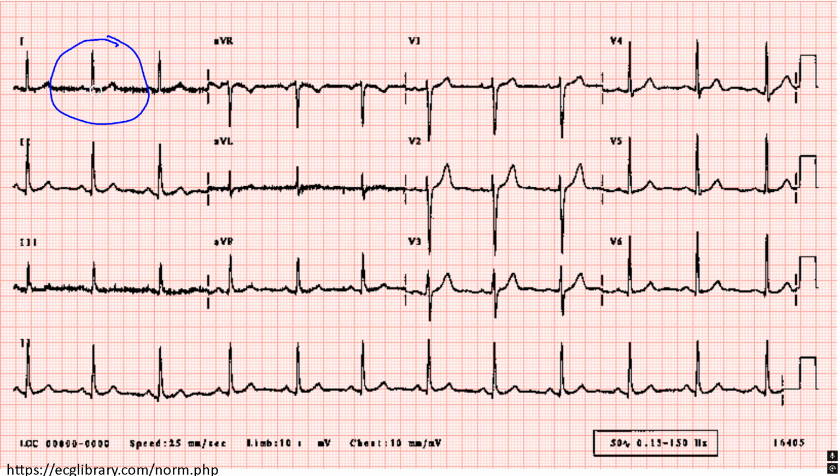There is the PR segment. There's the J-point. There's no deviation. The T wave is not hyperacute, and it's upright as it should be, which is normal. Same issue here, no J-point deviation and T-wave is upright. Same issues here, okay, no J-point deviation. I mean, technically the T-wave is flat, which, some of you got to report, but again, no inversion.